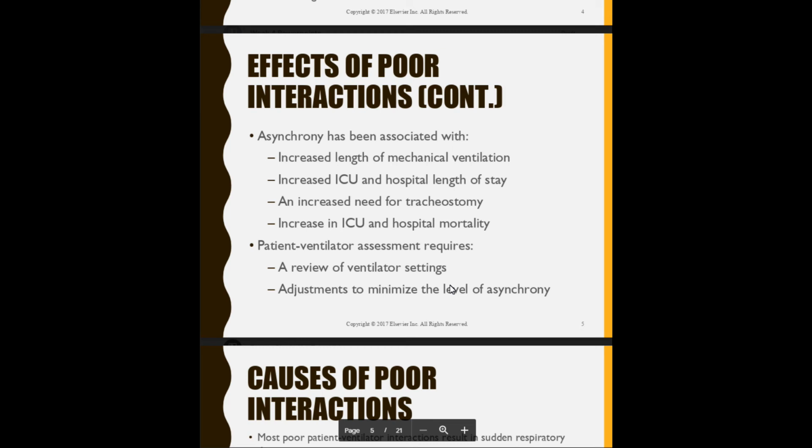And how much more horrible it would be if you as a therapist caused the asynchrony, which increased the length of stay, which cost the hospital a lot of money, and now you gave this patient a tracheostomy.